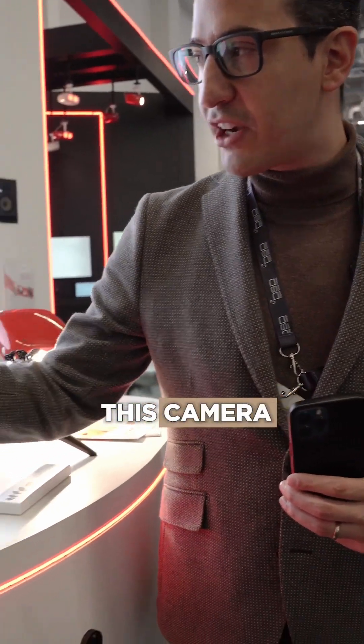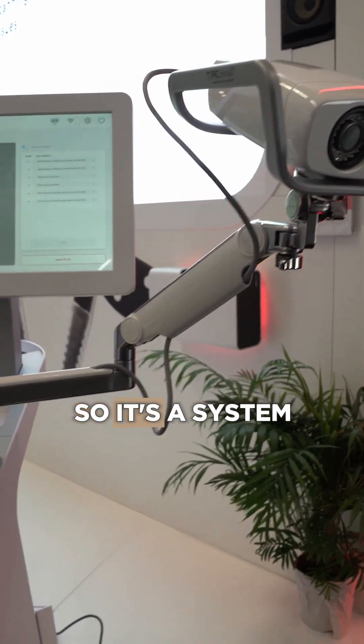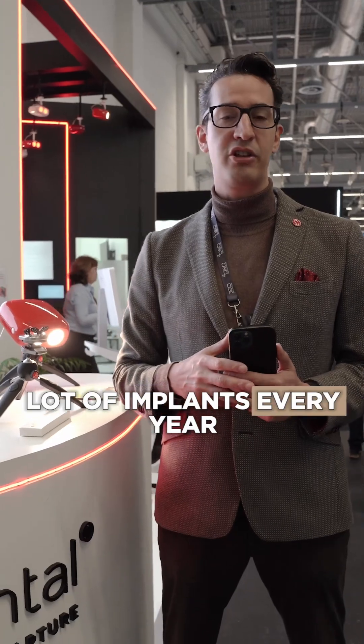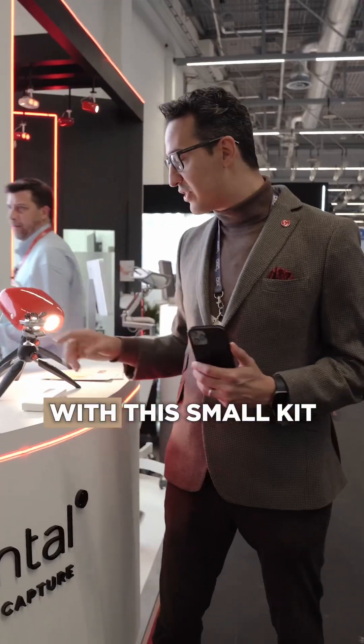In the past, we were supposed to use this camera that is connected to a computer. There are different options, so it's a system that makes sense for dentists that are placing a lot of implants every year and doing many full arches. So what they did is bring all this technology to every dentist in the world with this small kit.